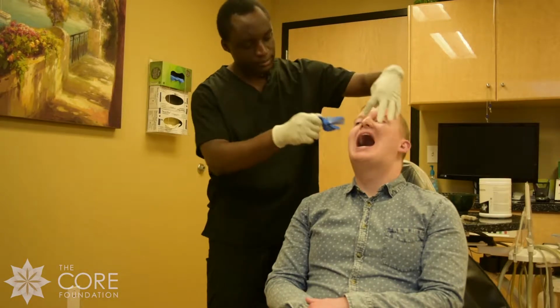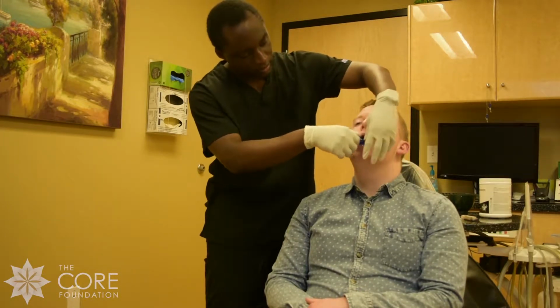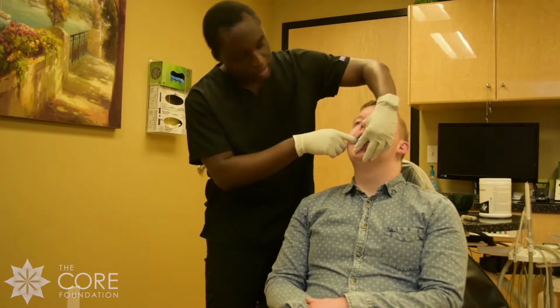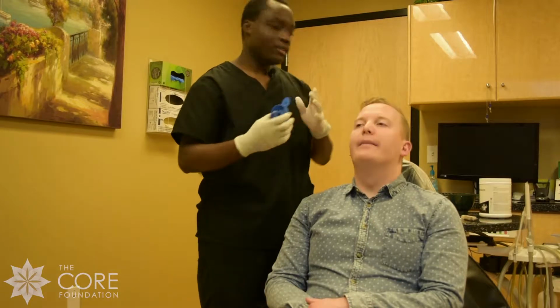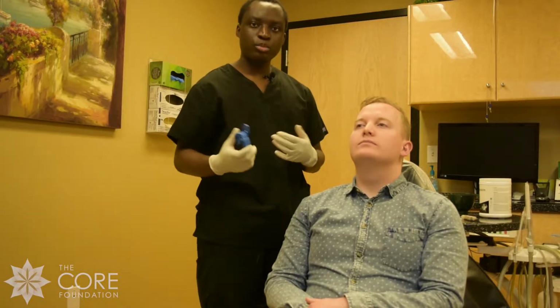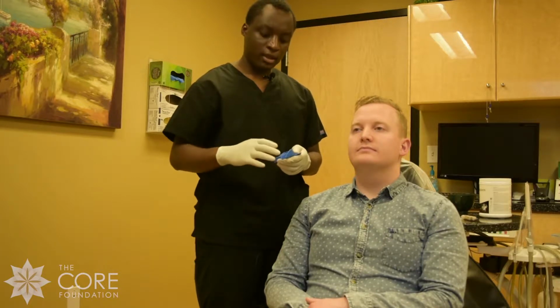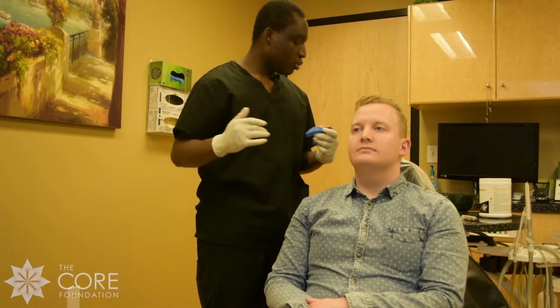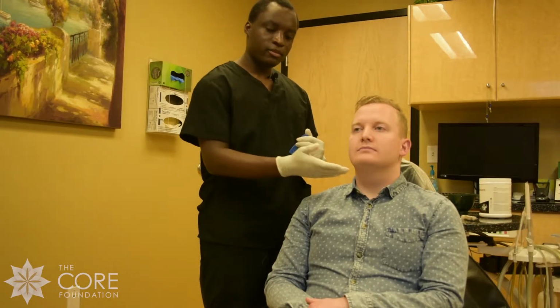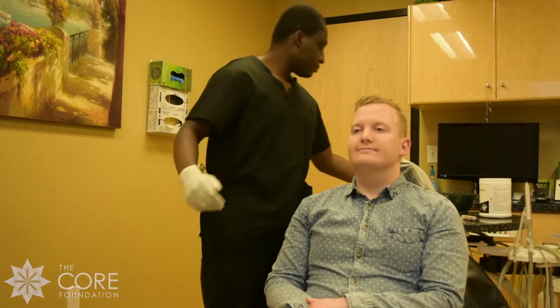Go ahead and open. All right. The medium also fits really well. So in this case, you have your option. You can choose a small or you can choose a medium. I'm just going to choose the medium just because it's a lot bigger, and if there's anything missing, it can pick it up. So we'll go with a medium for the bottom and also a medium for the top.